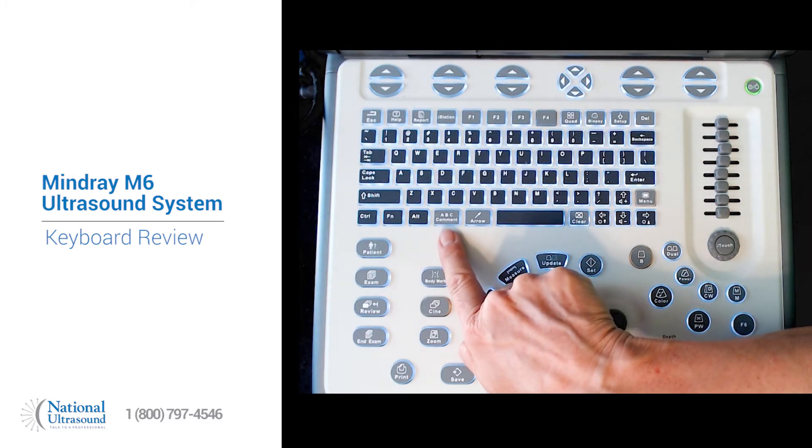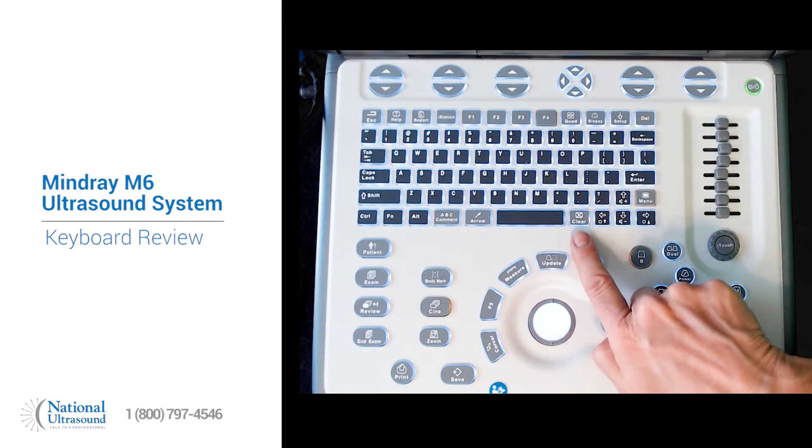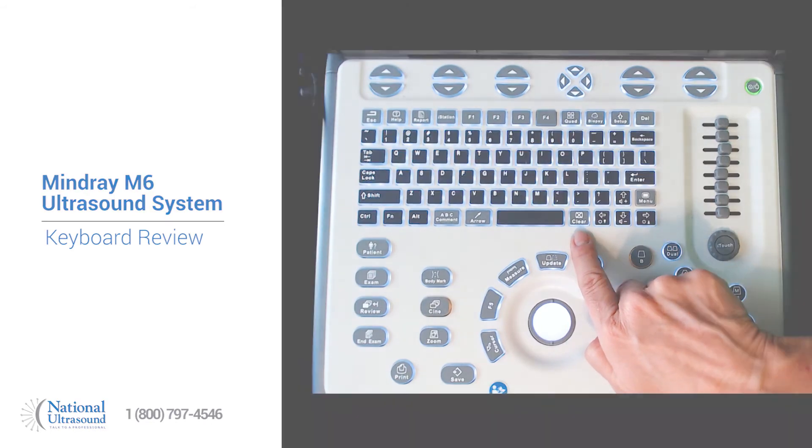Along the bottom you have a comment button, arrow, your spacebar, and clear which will clear text or measurements.